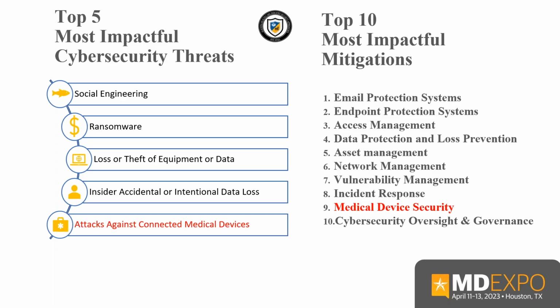They're designed for remote access by manufacturers. People like to either get in them to use them for a botnet, sucking the processing power out of them, or use them to come in and move laterally into maybe the Active Directory system and escalate privileges, or if they would like to, they could shut down devices. You can hack an infusion pump and deliver all the contents into someone. That's scary. But we've never seen anything like that out there. But you can do it. Medical devices are hooked to patients, so they're problematic. We always knew that.